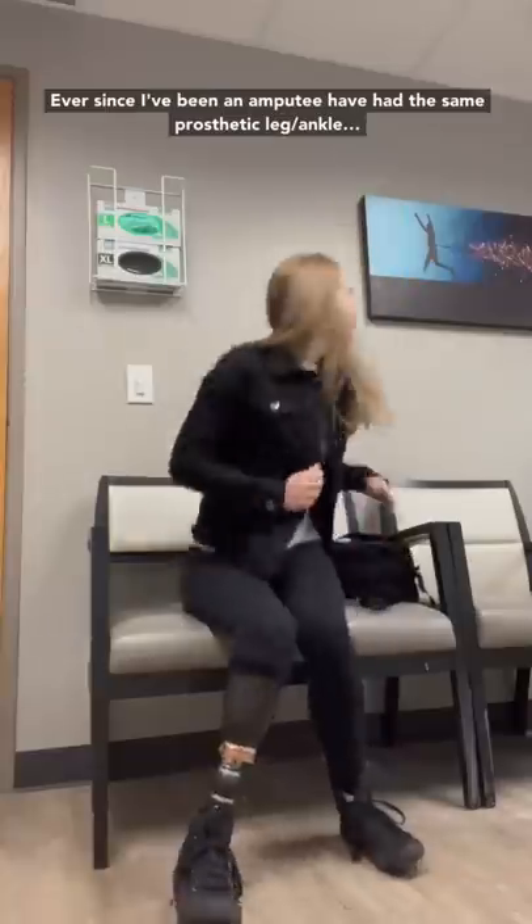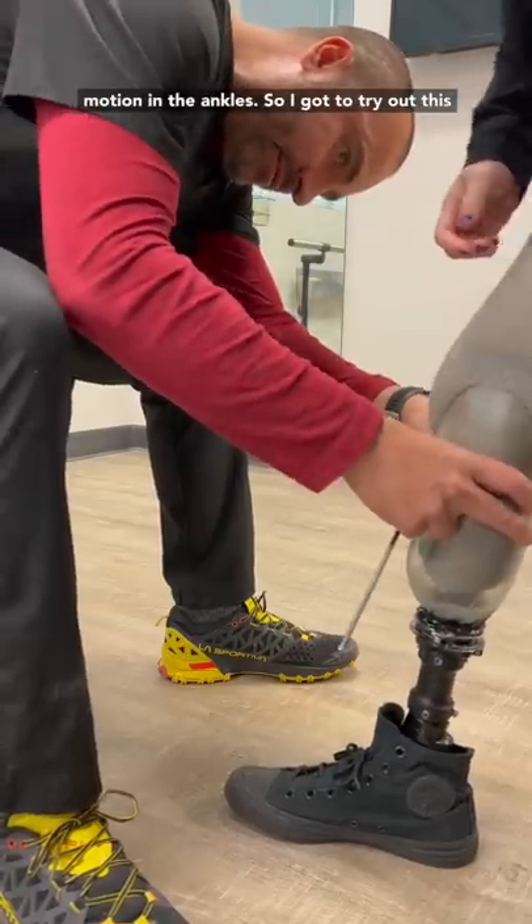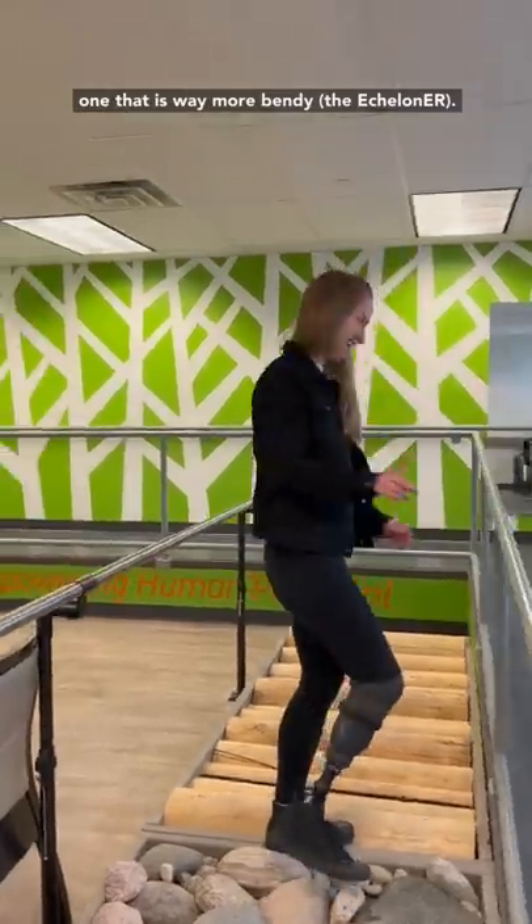Let's go try a new prosthetic ankle. Ever since I've been an amputee, I've had the same leg — it works great, but there isn't a whole lot of motion in the ankle. So I got to try out this one that is way more bendy.